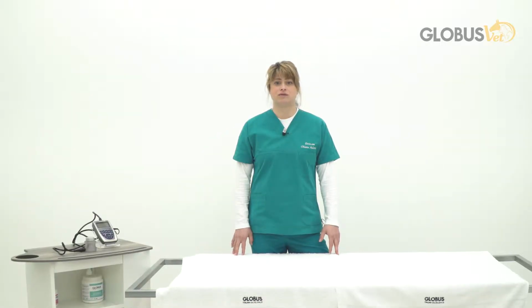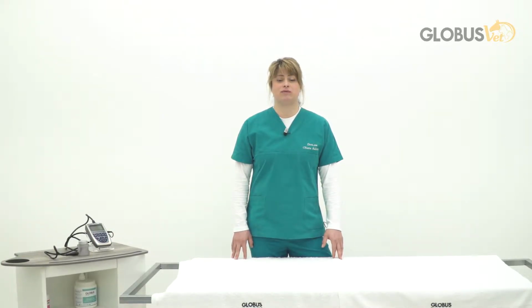Do not use ultrasound therapy in the immediate post-operative period, and it is always advised to wait at least 15 days after surgery before starting the treatments. The number of sessions varies according to specific disorders, and as a rule of thumb, acute disorders require fewer sessions, whereas chronic disorders require longer cycles of treatment. The cycle of treatment generally ranges from 10 to 12 sessions.